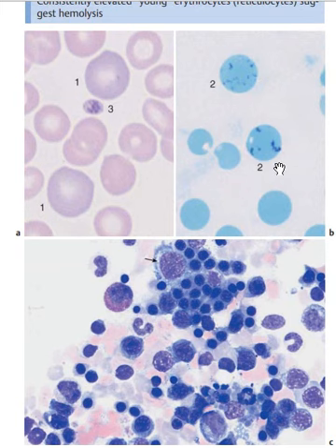When you use the normal hematoxylin eosin stain, the red blood cells and the reticulocytes are not easily distinguishable on the microscope. You see that these cells here and these cells here are not distinguishable, but this is actually a reticulocyte, while this is a red blood cell.